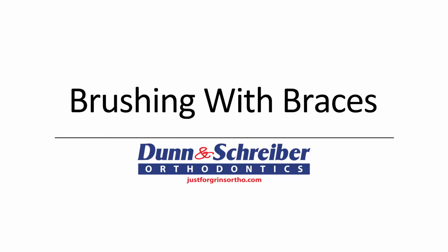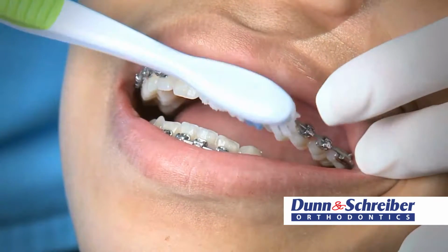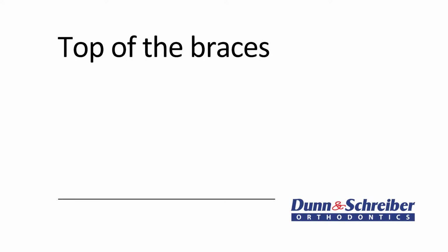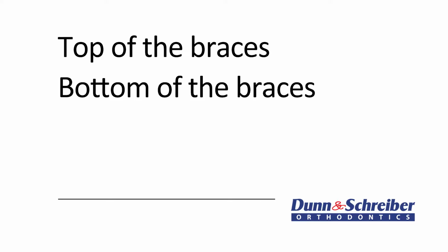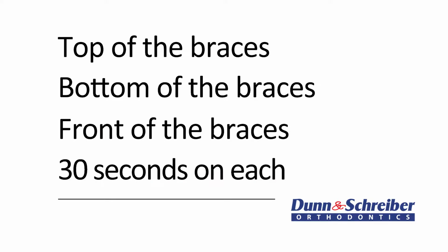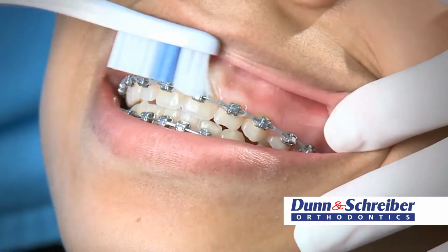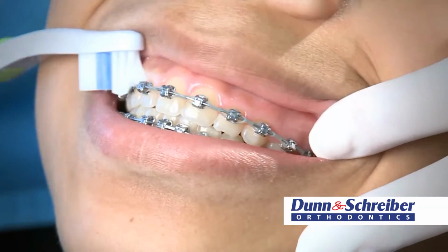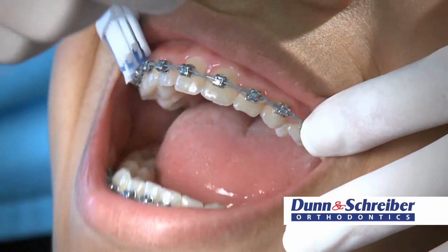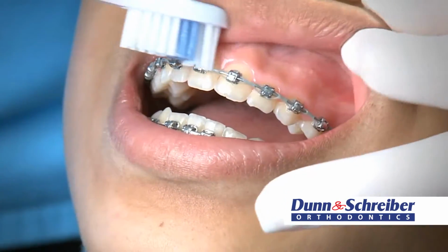And let's start with how to brush your teeth with braces. You'll move your toothbrush in a circular motion and turn it in 3 different positions: the top of the braces, the bottom of the braces, and the front of the braces, spending at least 30 seconds in each position. So start with the top of the braces and brush down on the top of the braces with just enough pressure on the brush to get the tips of the bristles under the wire. Brush from one side to the other several times and then move on to the next angle.